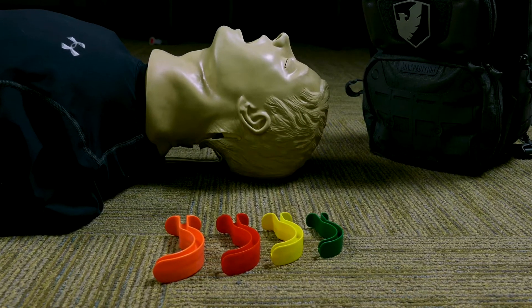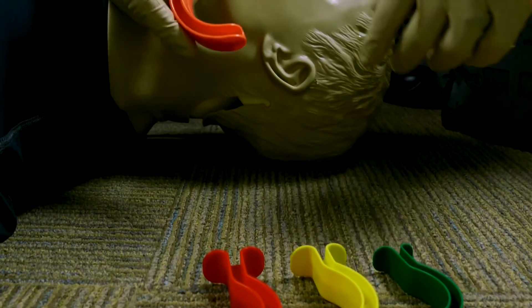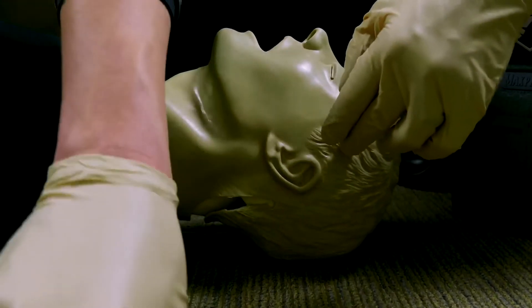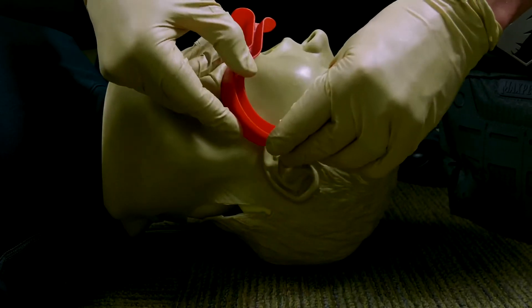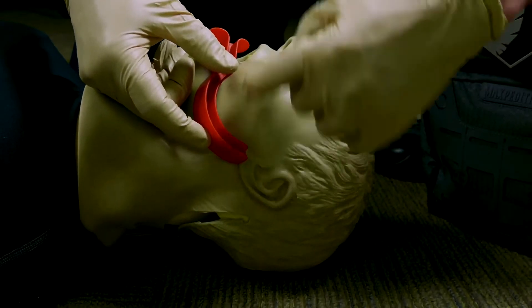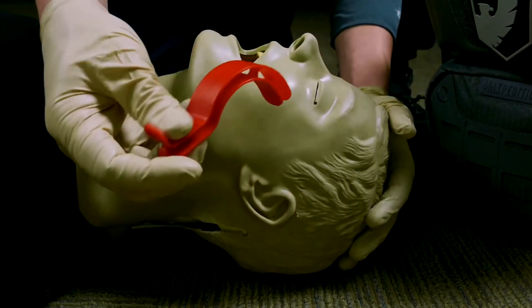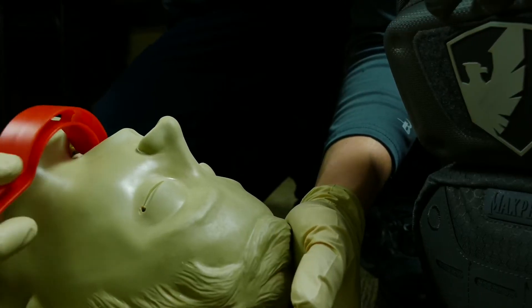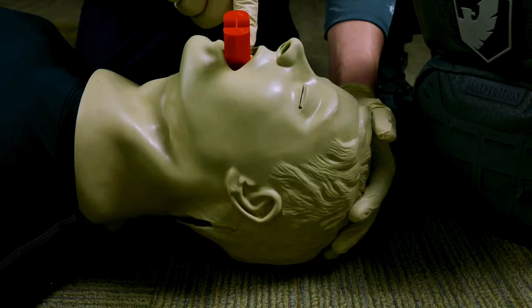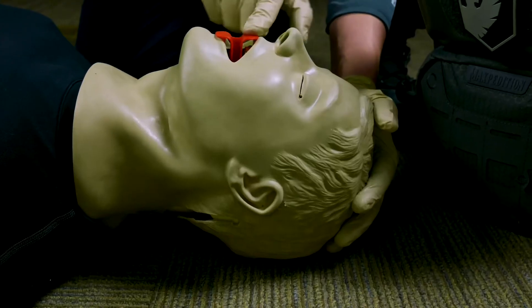To size the OPA, measure from the earlobe to the corner of the mouth. I have several sizes here — this larger one is too big for this patient, so let's try the red one, which runs correctly from earlobe to corner of the mouth. To insert the OPA, slide it in sideways into the mouth, hooking between the tongue and the roof of the mouth, advance about two-thirds of the way, then rotate it down following the curvature of the mouth until it sits all the way up against the teeth.